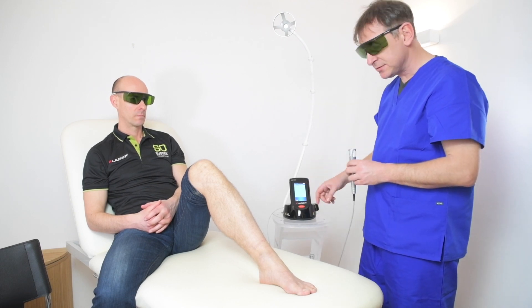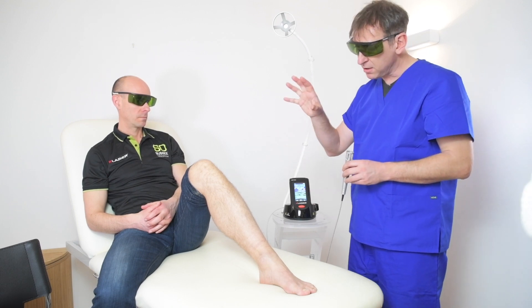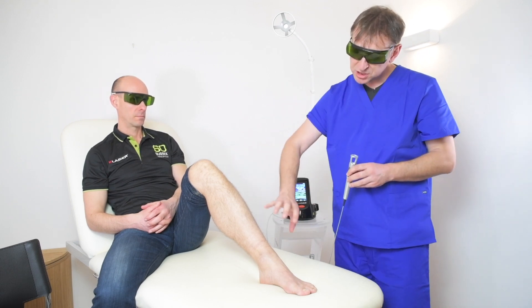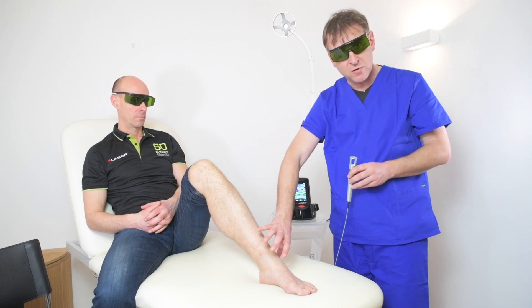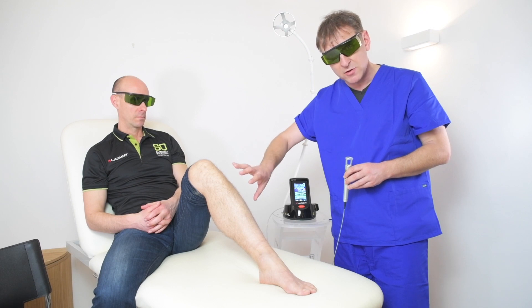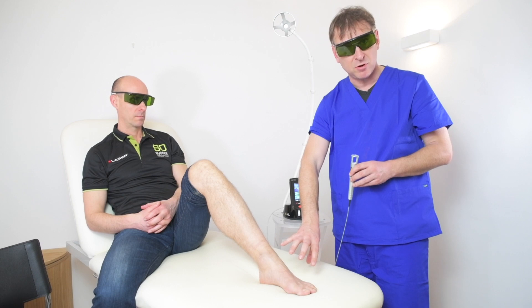The machine is calibrated to allow you to go and do treatments. There are specific treatments that are able to treat not just the wound itself, but we've learned that you needed to treat the whole of the lower leg — and until we treated the whole lower leg, we were not approaching the dynamics that were preventing that healing properly.